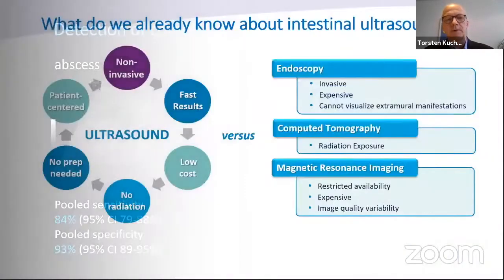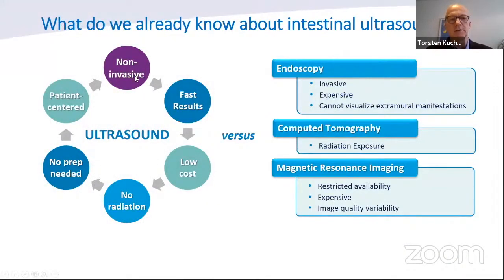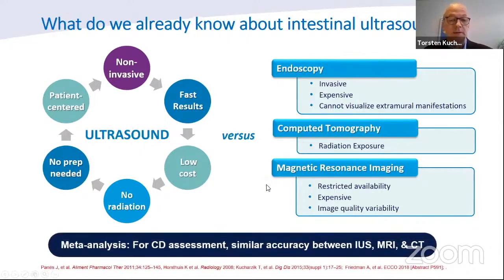So there are a lot of advantages. As you heard, it's non-invasive. You can receive fast results. It has low costs. There's no radiation. There's no prep needed. It's patient-centered. So a lot of advantages over other imaging modalities that we use and have. Over endoscopy, which is invasive, expensive, and cannot visualize the extramural inflammation, or over computed tomography, which has radiation exposure, and over MRI, which has restricted availability.